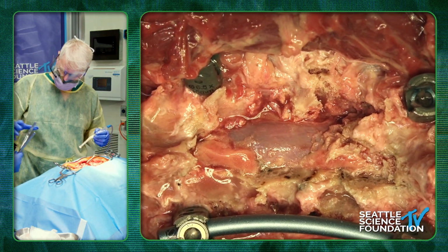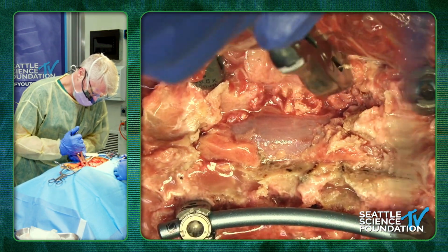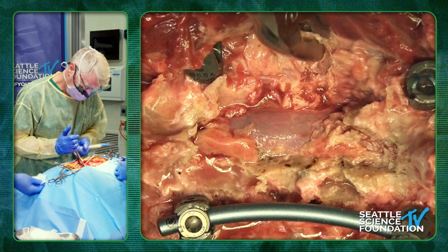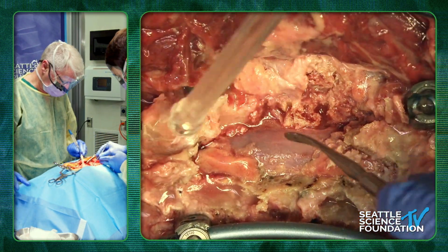I have another sterile one coming. Okay. Thanks. So what I want you to dissect the nerve root off the pedicle there.